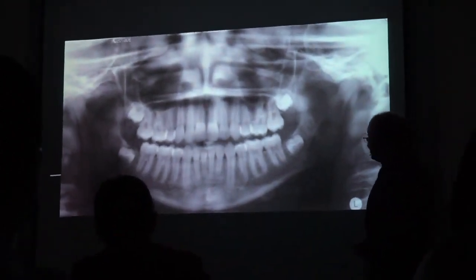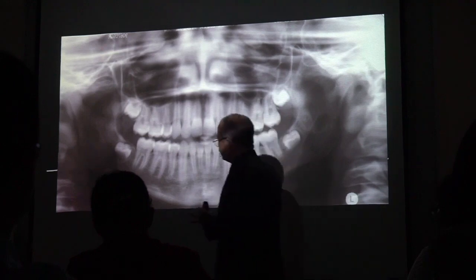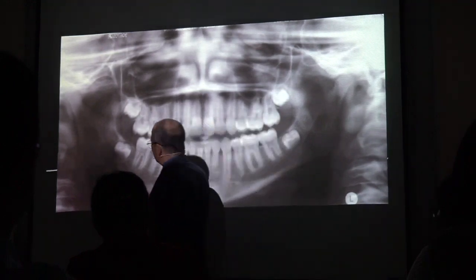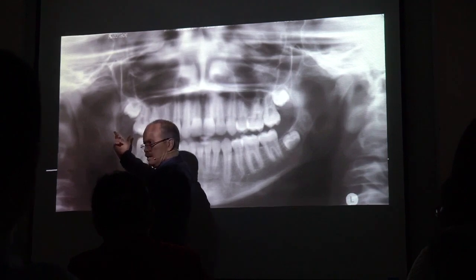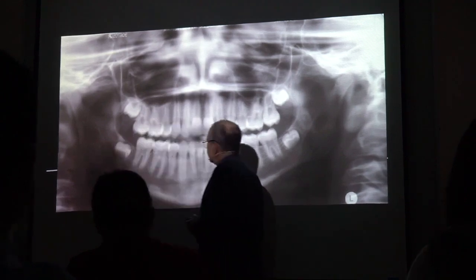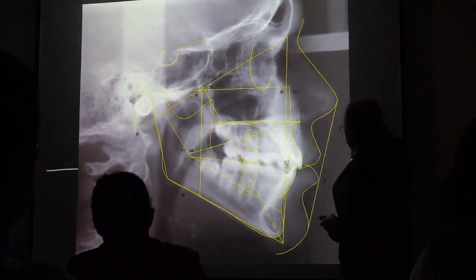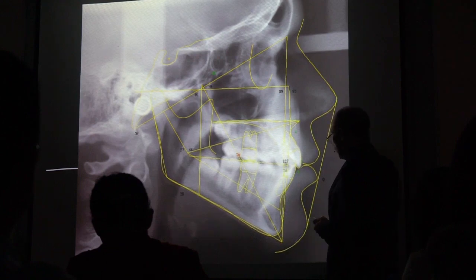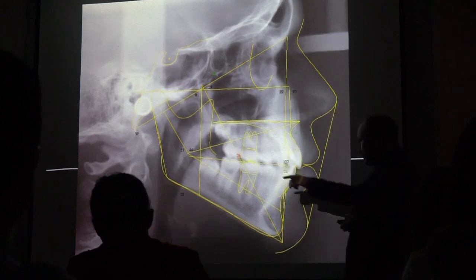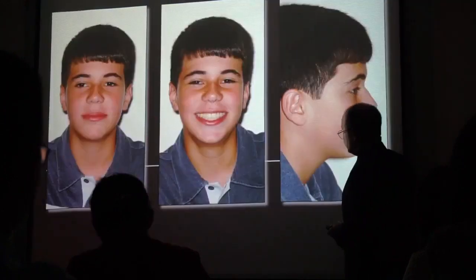I like a lot when I do these serial extraction cases because many of them can erupt the third molar. This is after, I think, a 15-year-old, and I have this X-ray here, so I can do an exercise with this.